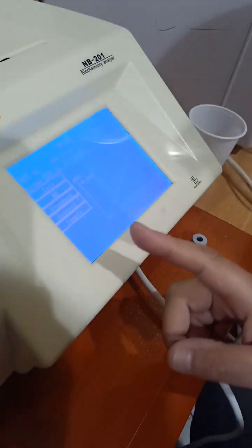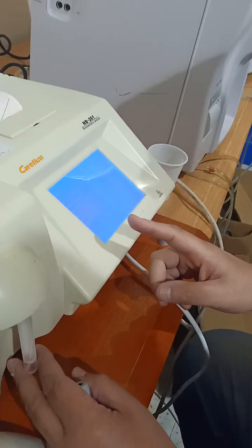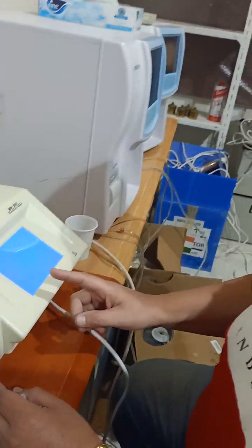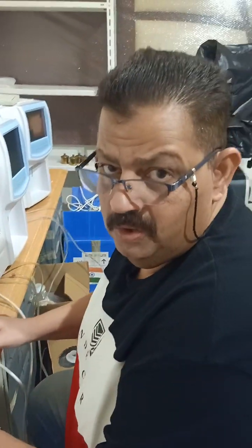That's all for a small demonstration for biochemistry analyzer. Thank you.